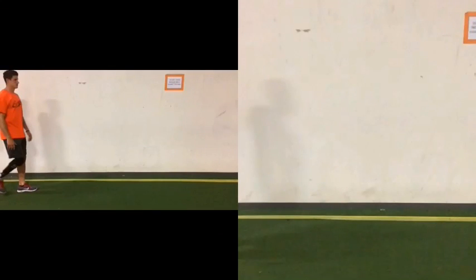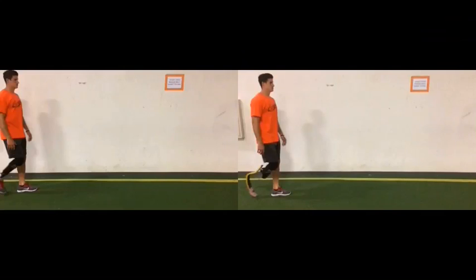Hey guys, we're going to be comparing on the left screen a highly active walking foot to a sprinting foot. Both feet are highly active, just made for different uses. And right now we're just comparing the walking gait. The prosthetic is our reference limb, and let's go ahead and watch this.